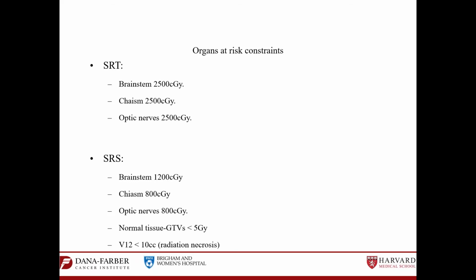So what would be the best way to bring the hot area in the center of the field? The maximum approved for the hotspots in the SRS plan is up to 140%, not more than that. 140% of the prescribed dose. Yes, but how do we do that?